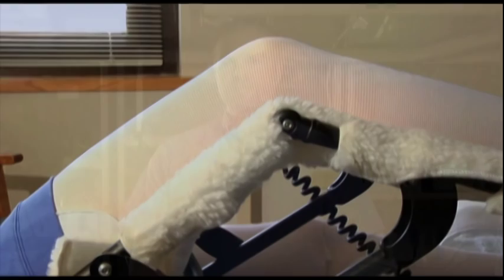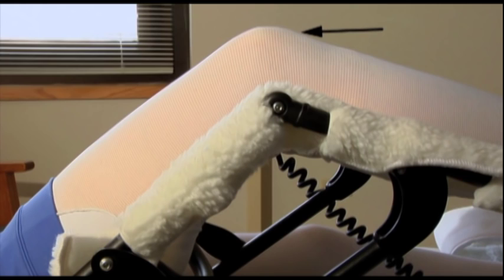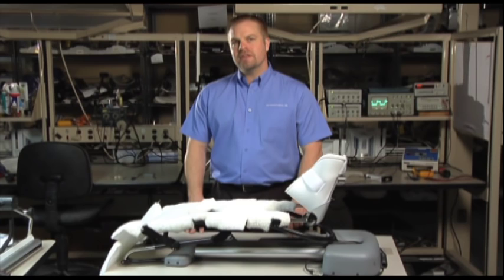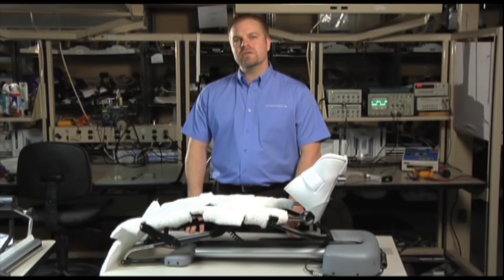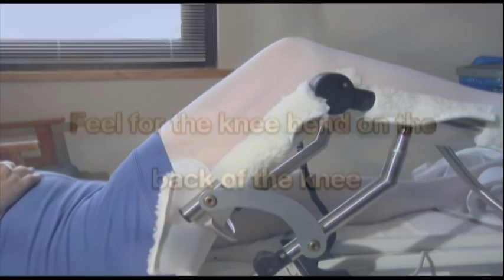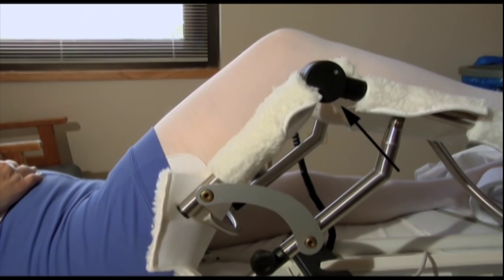Once the pad kit is properly installed, the most important part of fitting the CPM to the patient's leg is to make sure the knee bends in the same place as the CPM machine. On occasion, some patients may have an extra heavy dressing following their procedure. When this occurs, you may need to feel for the knee bend by placing your hand in the popliteal fossa region of the patient's leg or the back of the patient's knee. Although it is ideal to have the knee hinge aligned exactly with the CPM hinge, it is acceptable to locate the knee an inch on either side of the hinge on the knee CPM.